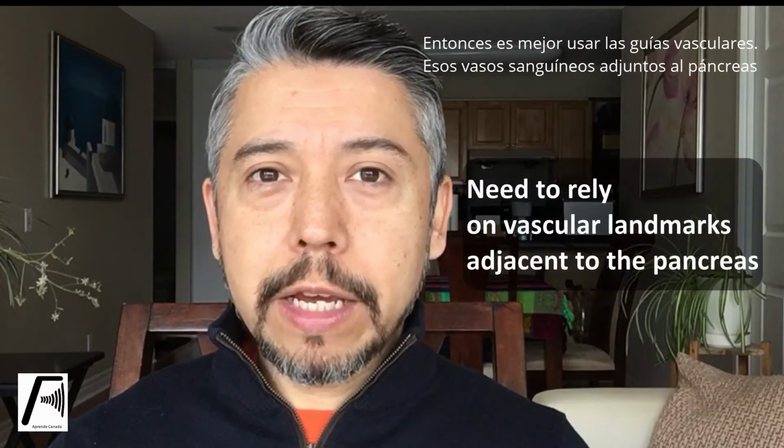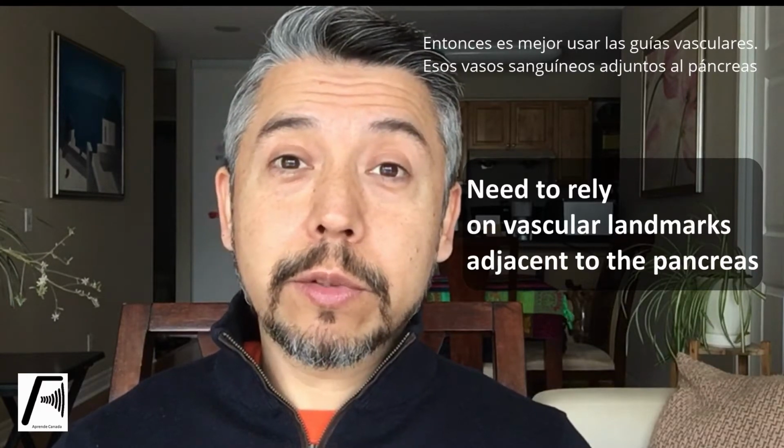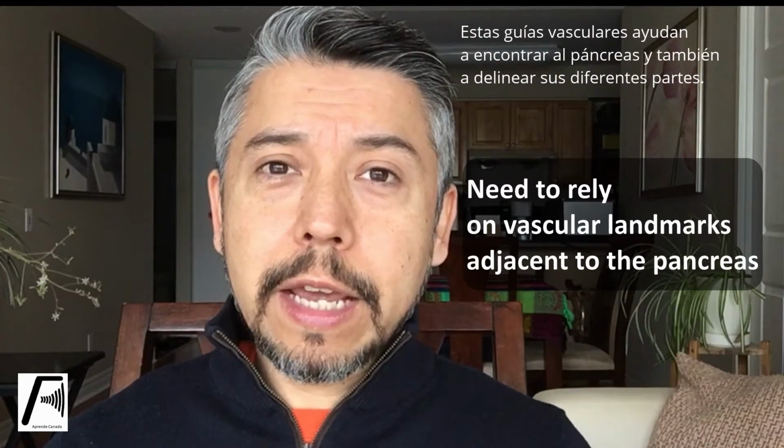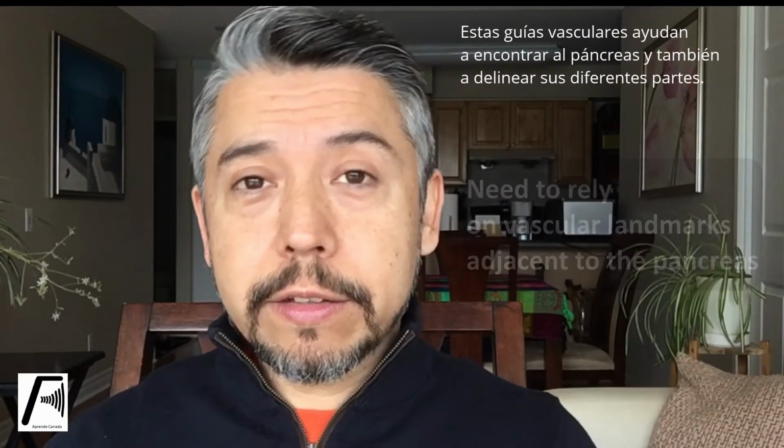And so we have to rely on those vascular landmarks, those vessels that are in the area of the pancreas that help us find it and also delineate the different parts of the pancreas. Adjusting to something like that, to look for something that is adjacent to the target, may be difficult, especially when we're used to looking for the actual target as opposed to what's next to the target. And so I remember seeing students and novice sonographers struggling also at finding them.